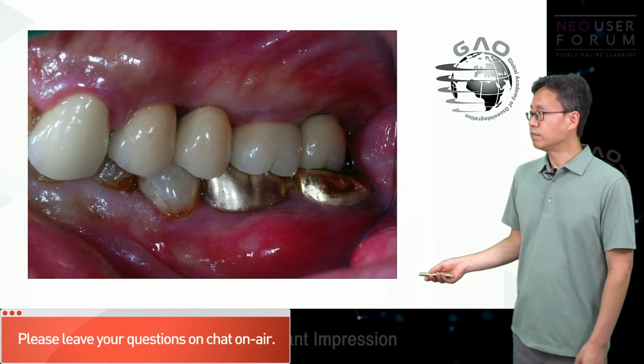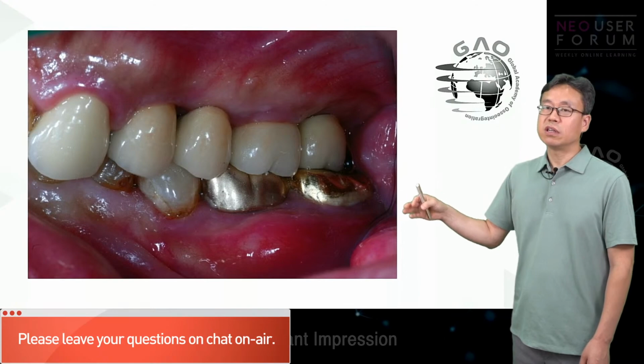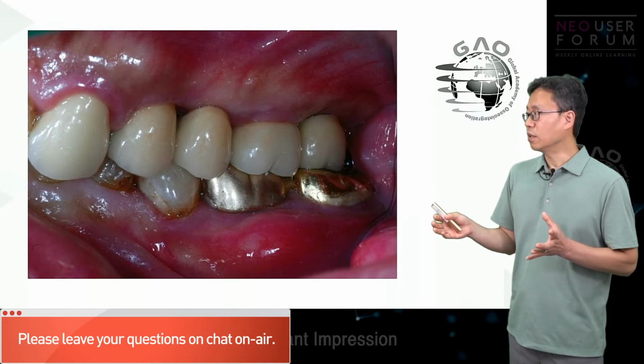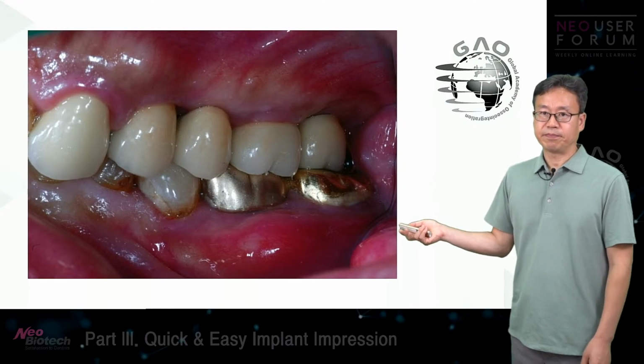Like this, you don't really need to reduce or change the occlusion in the patient's mouth during the delivery.